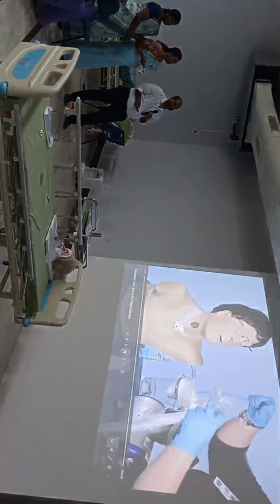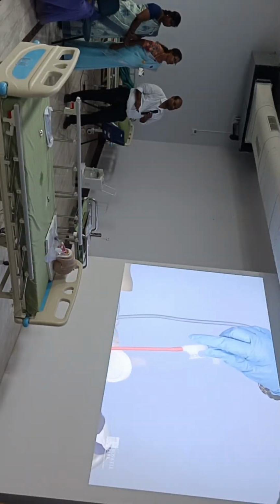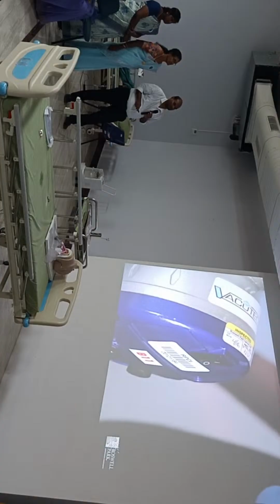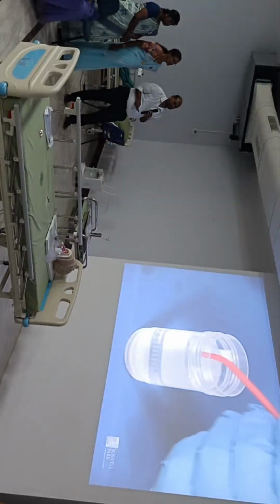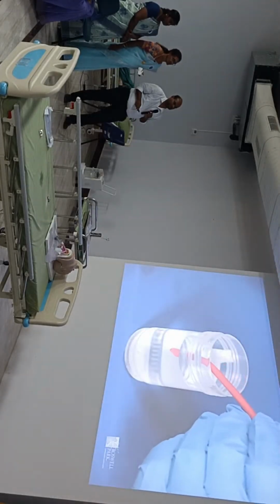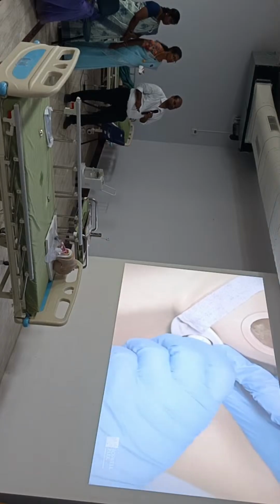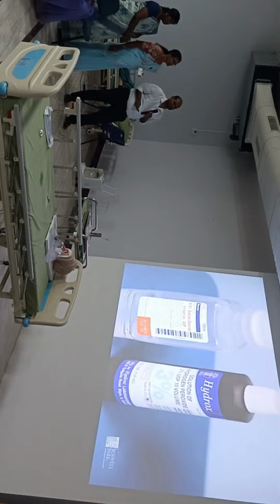Begin by opening the catheter and connect it to your portable suction. Remove the packaging and turn on the portable suction. To ensure the catheter is clean, put the end of the catheter into a clean solution and occlude the catheter. This allows suction to occur. Without placing the catheter down, remove the cannula and set it in a clean solution.